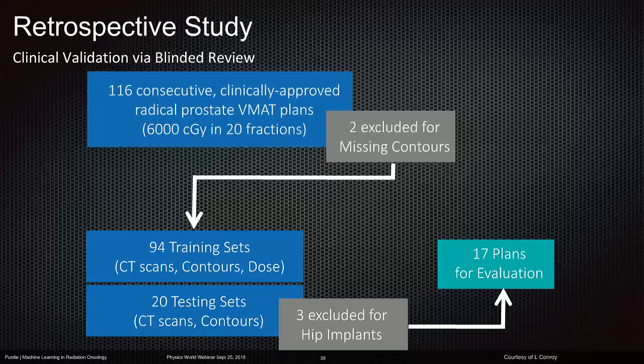Subsequent to that, we also recognized, and this was bad luck because we don't typically have more than 10% of our patients with hip implants, that 3 of the 20 patients we selected actually had hip implants.